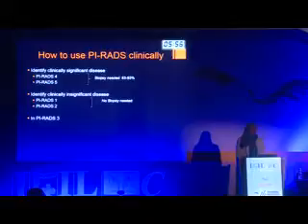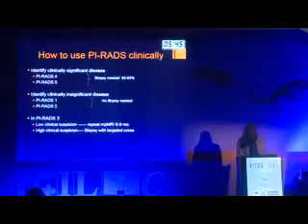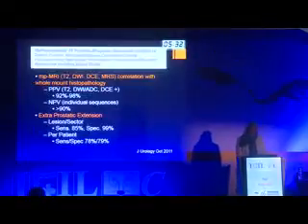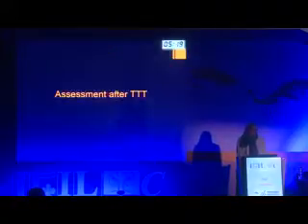What about PIRADS 3? For a PIRADS 3 patient, if there is low clinical suspicion, then we can repeat this MRI 6 to 9 months later. While if we have a high clinical suspicion, then biopsy should be performed, but not the routine TRUS biopsy. It should be a targeted biopsy from the lesions which are suspicious on MRI, and it is better to perform an MRI guided biopsy. And this is a published paper establishing the role of MRI, as we mentioned earlier, with high sensitivity, specificity and negative predictive value in assessing prostatic tumors.